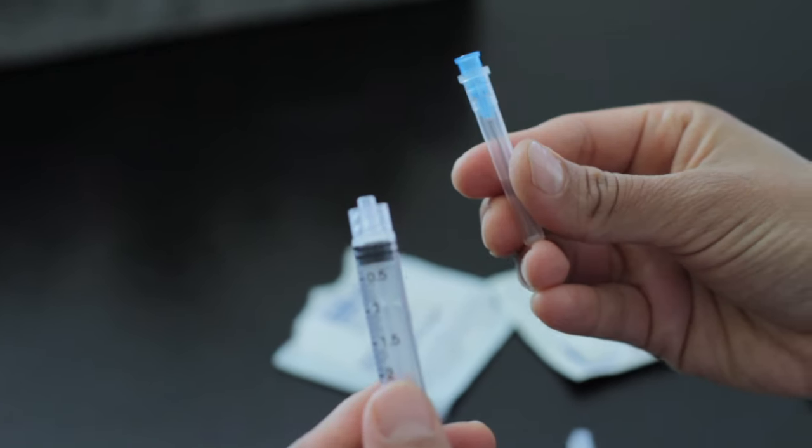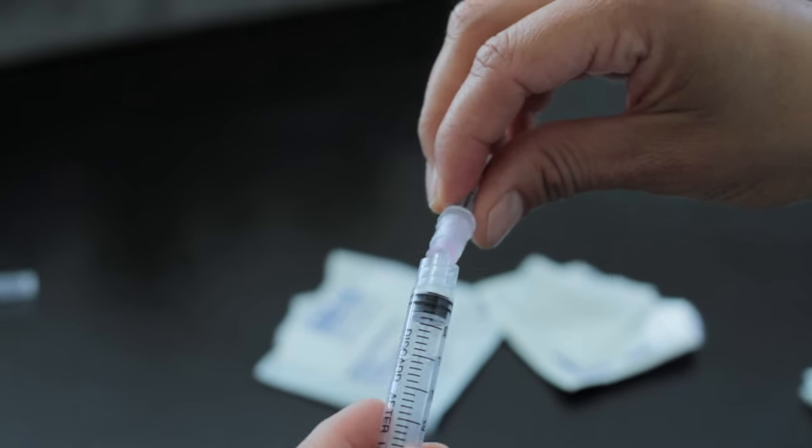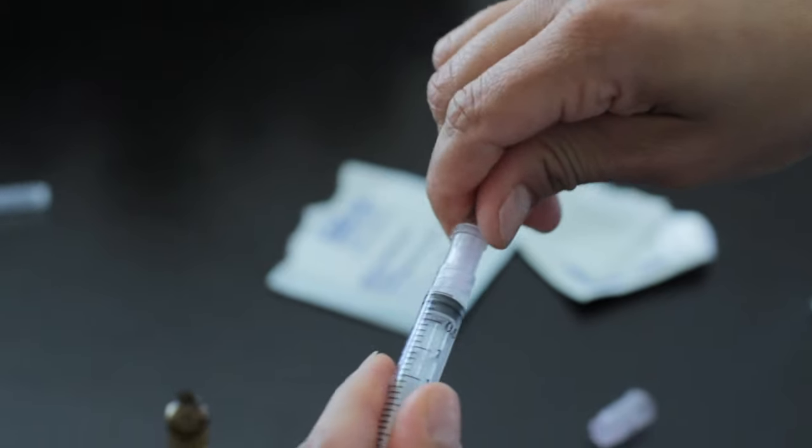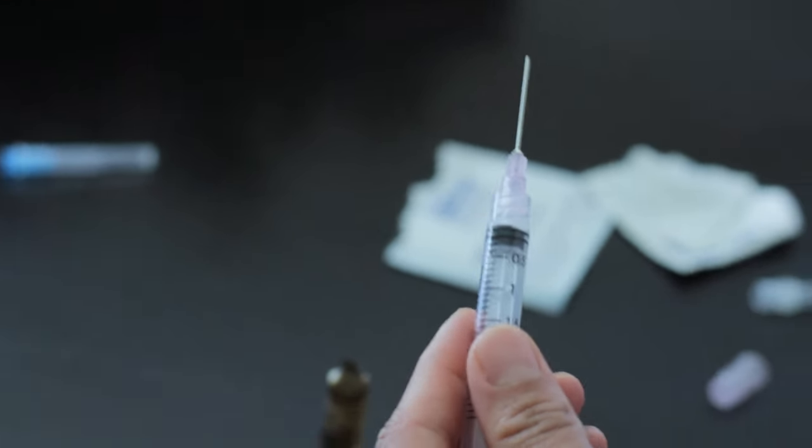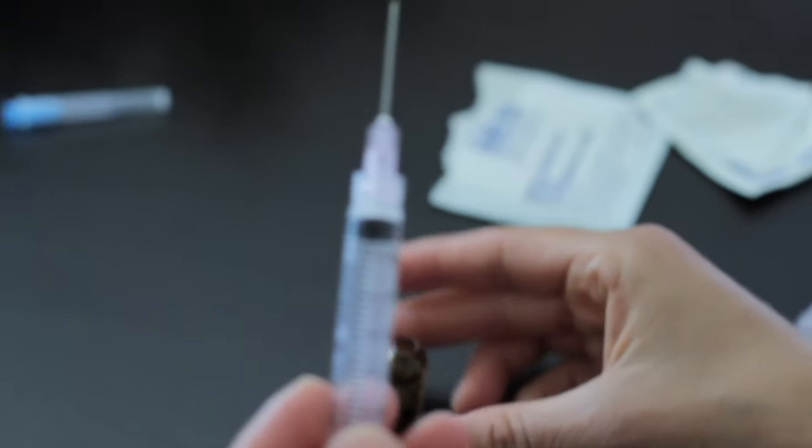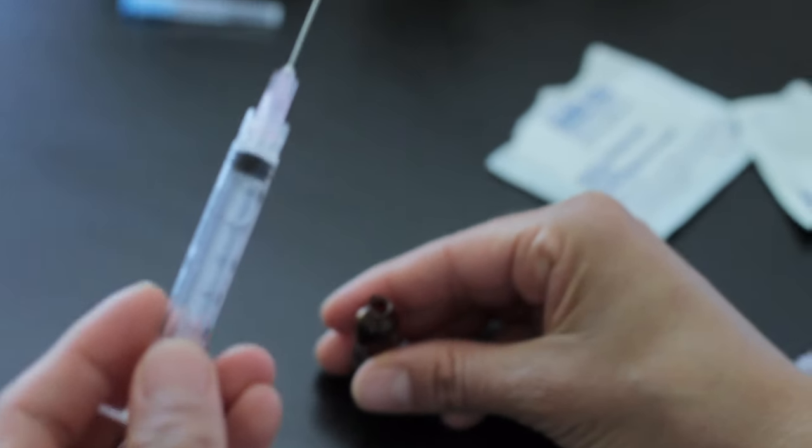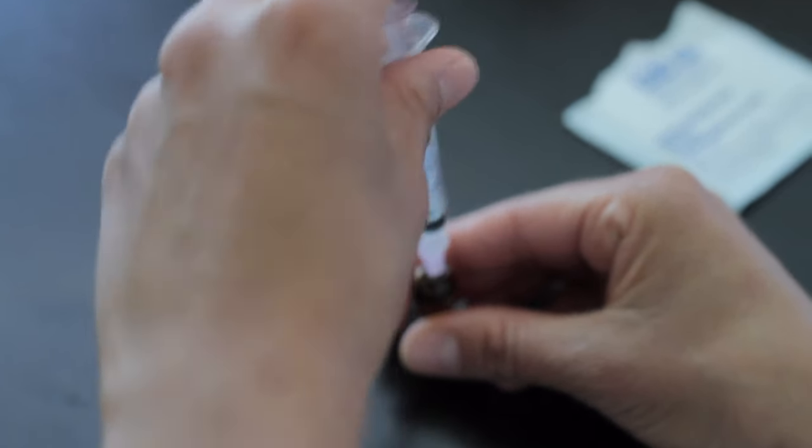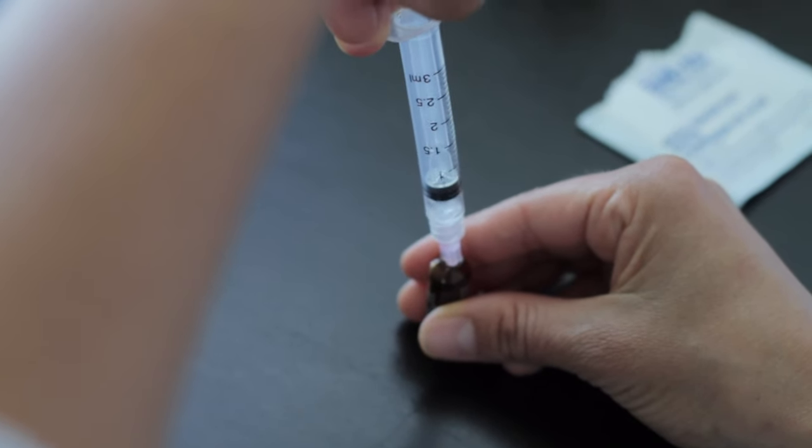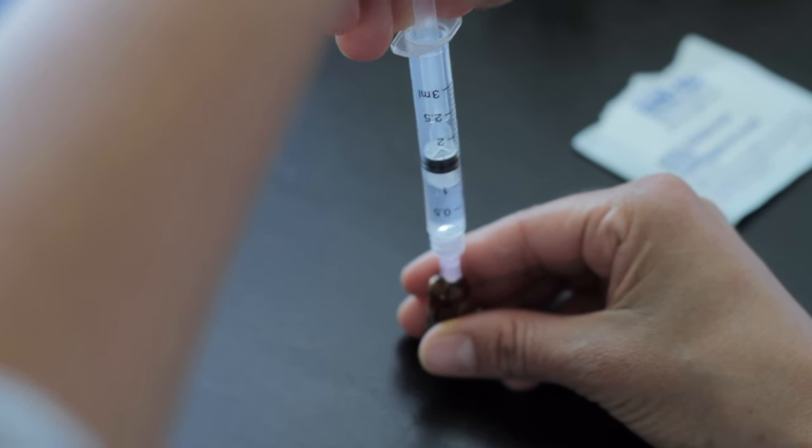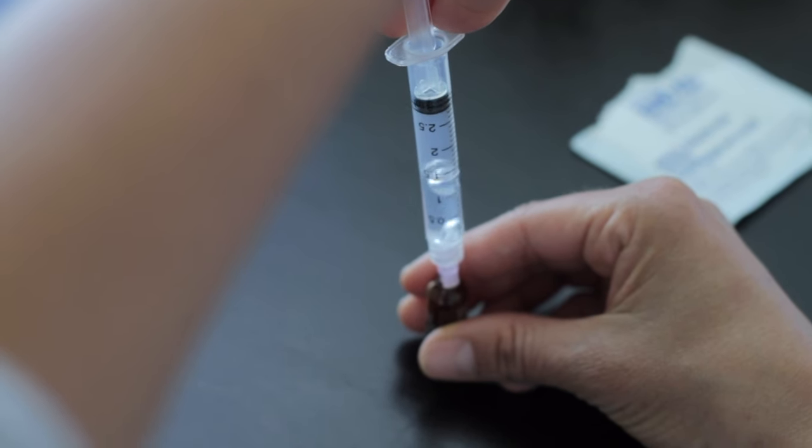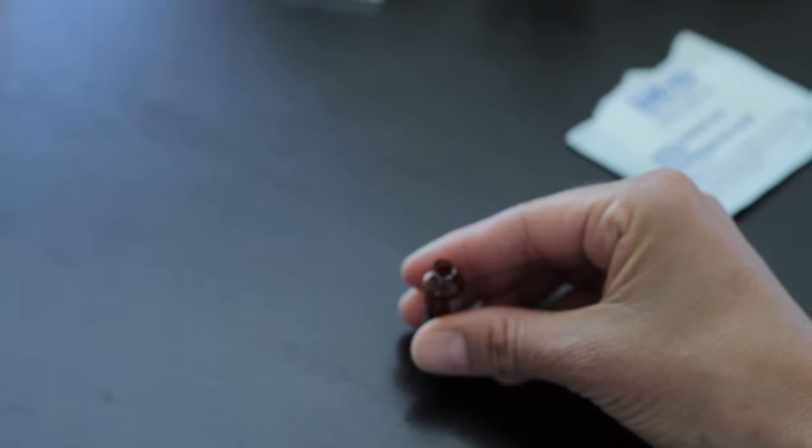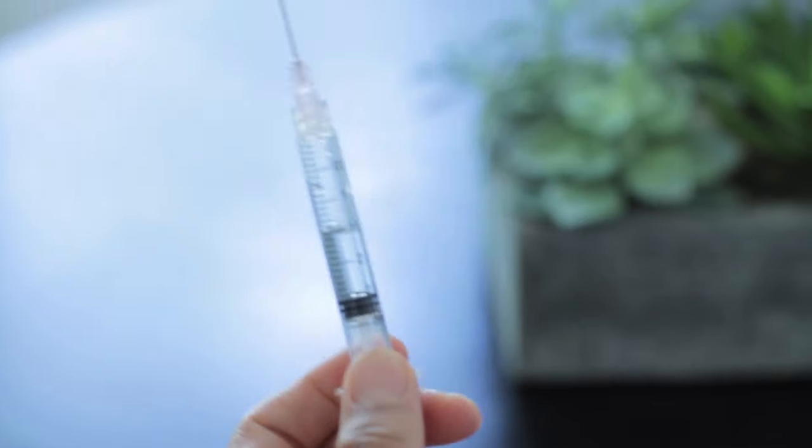Now we have our needle. We're going to detach the needle. We're going to apply the filter needle because we don't want any glass particles. Safety for the patient. We're going to remove the cap and then we are going to hold the ampule with our non-dominant hand. I'm a lefty, so I'm going to put the needle inside and I'm going to withdraw one mil of medication. And I have some air bubbles in there, so once I got that out, I'm going to adjust and get the air bubbles out.